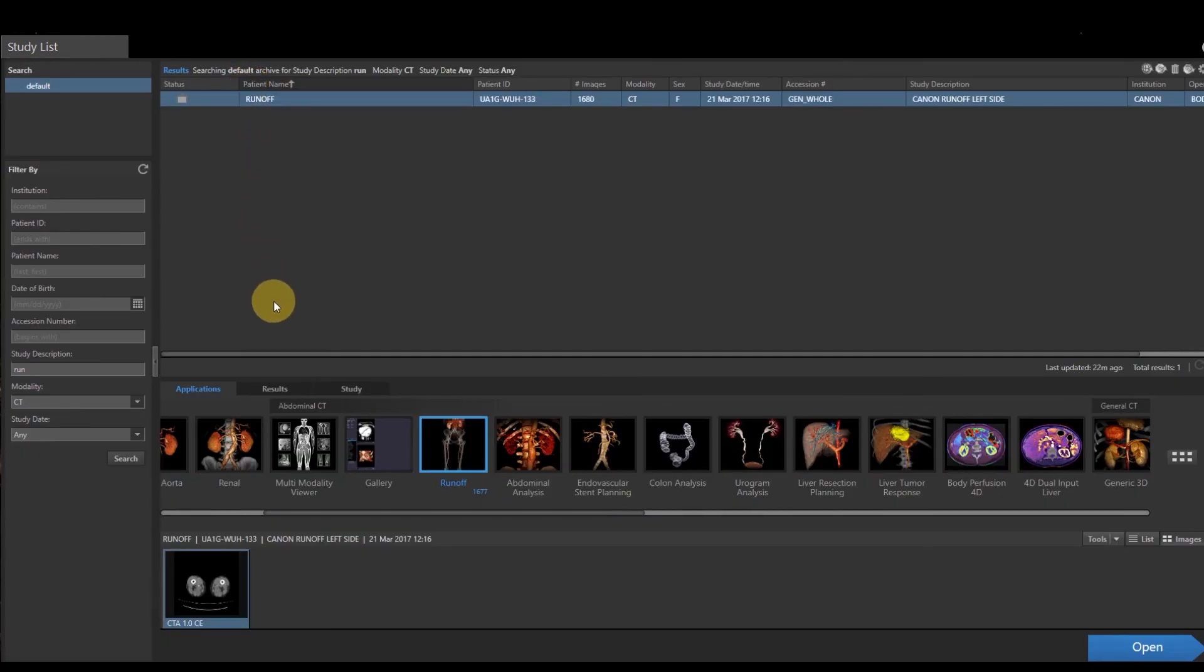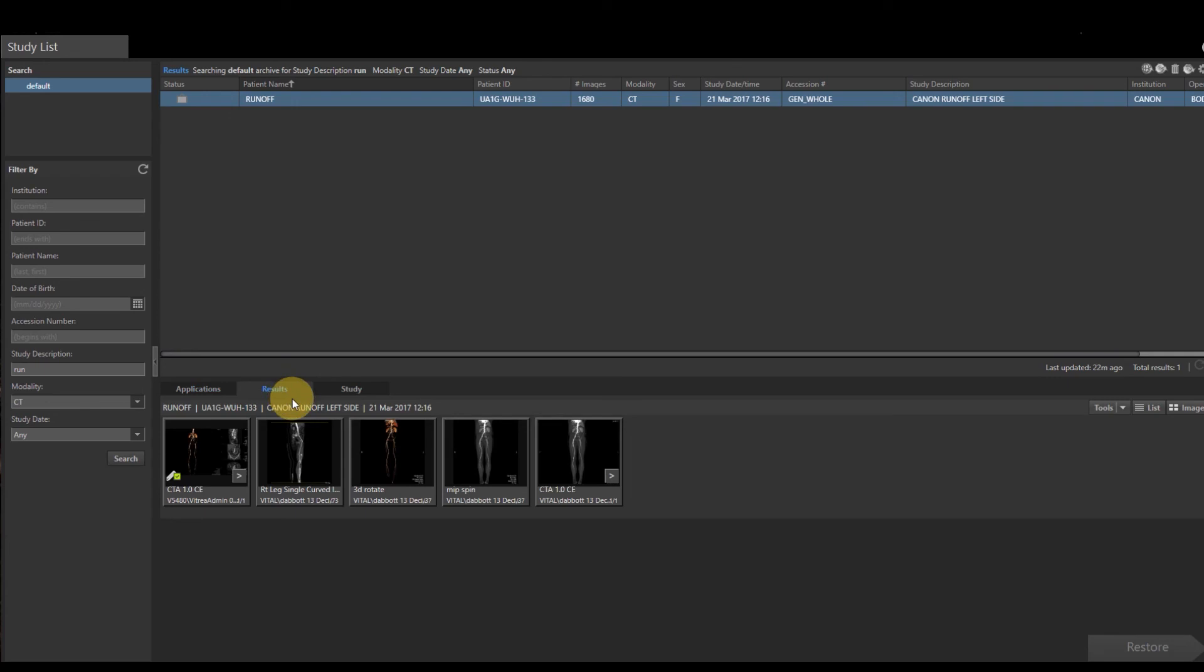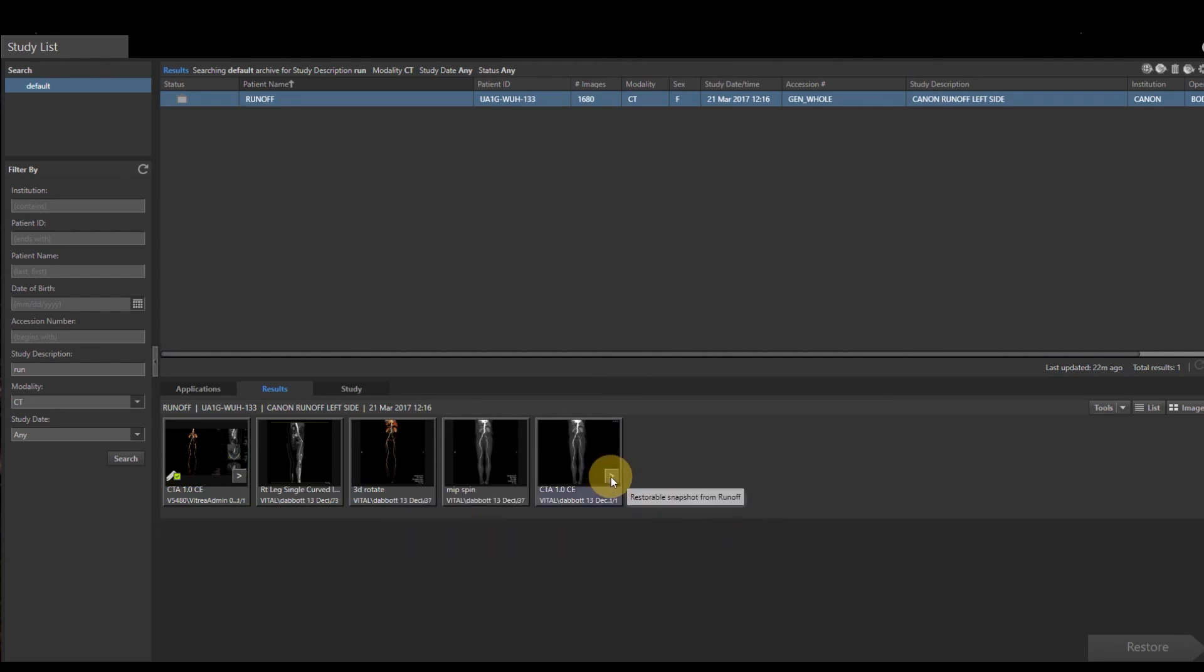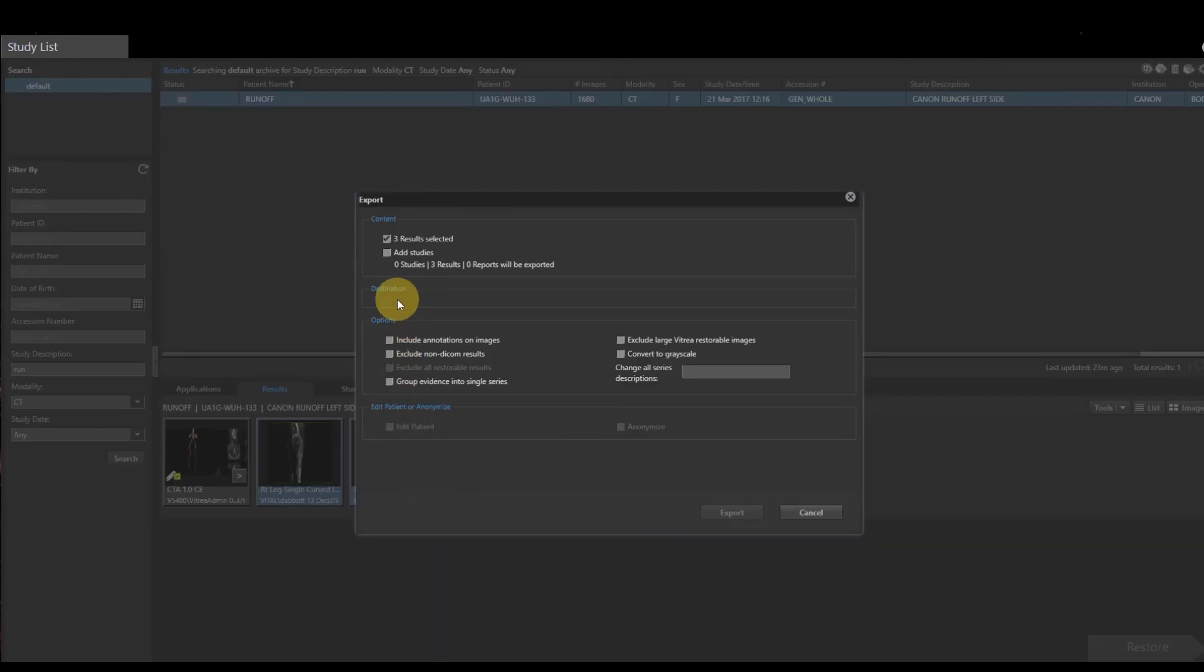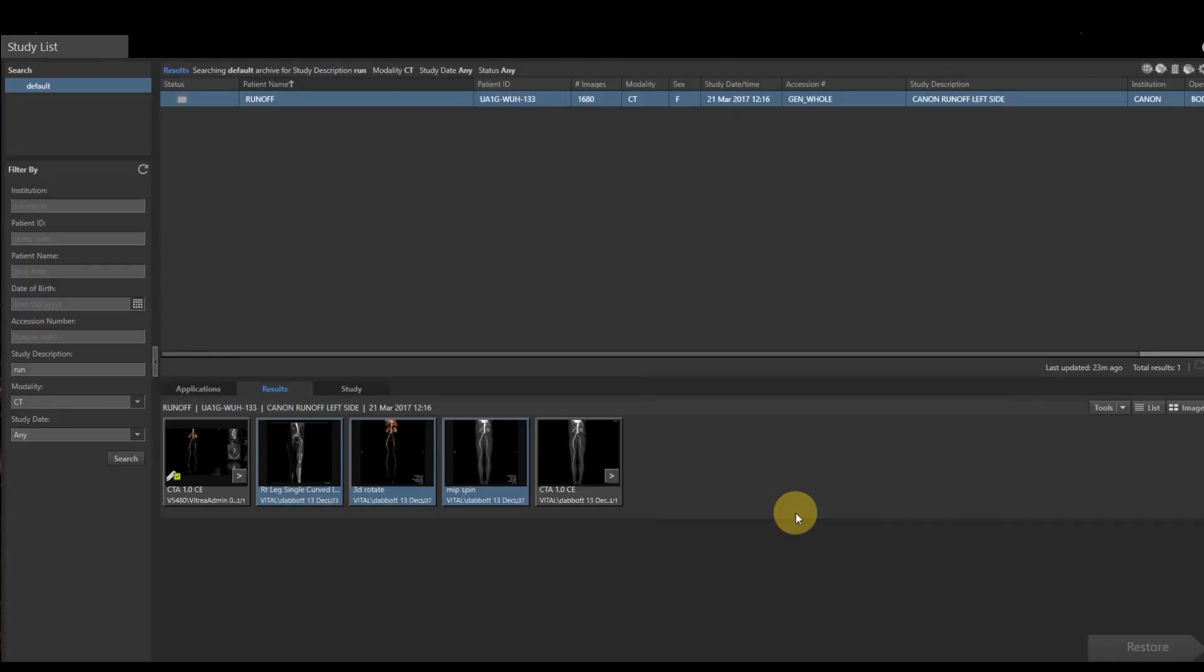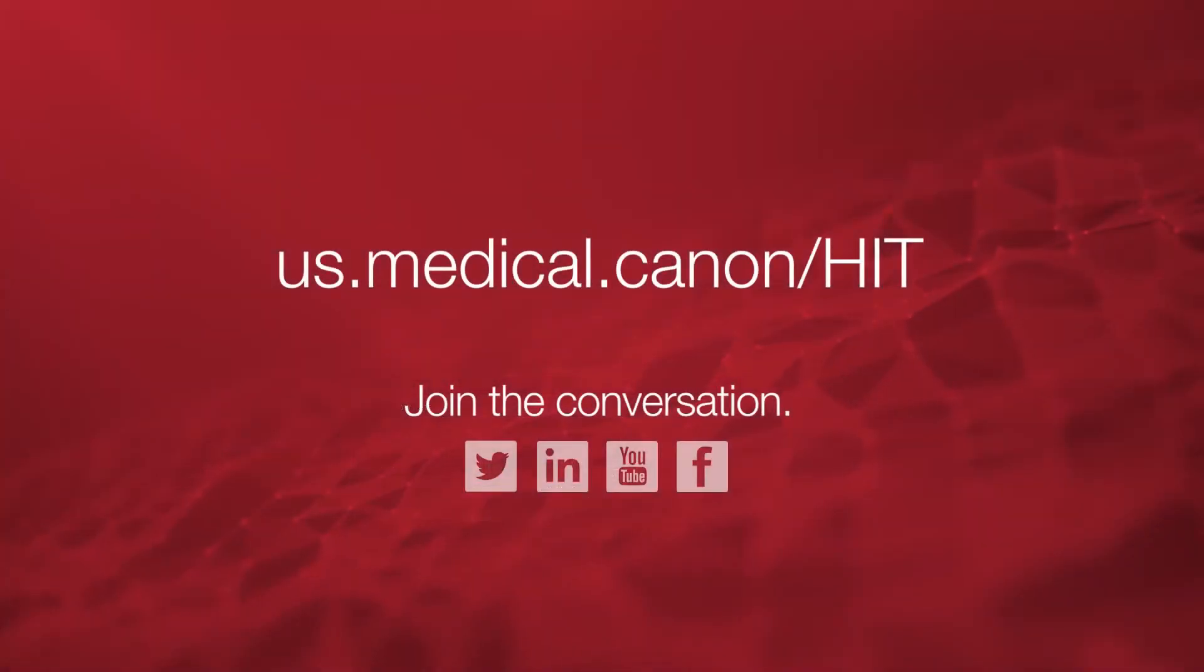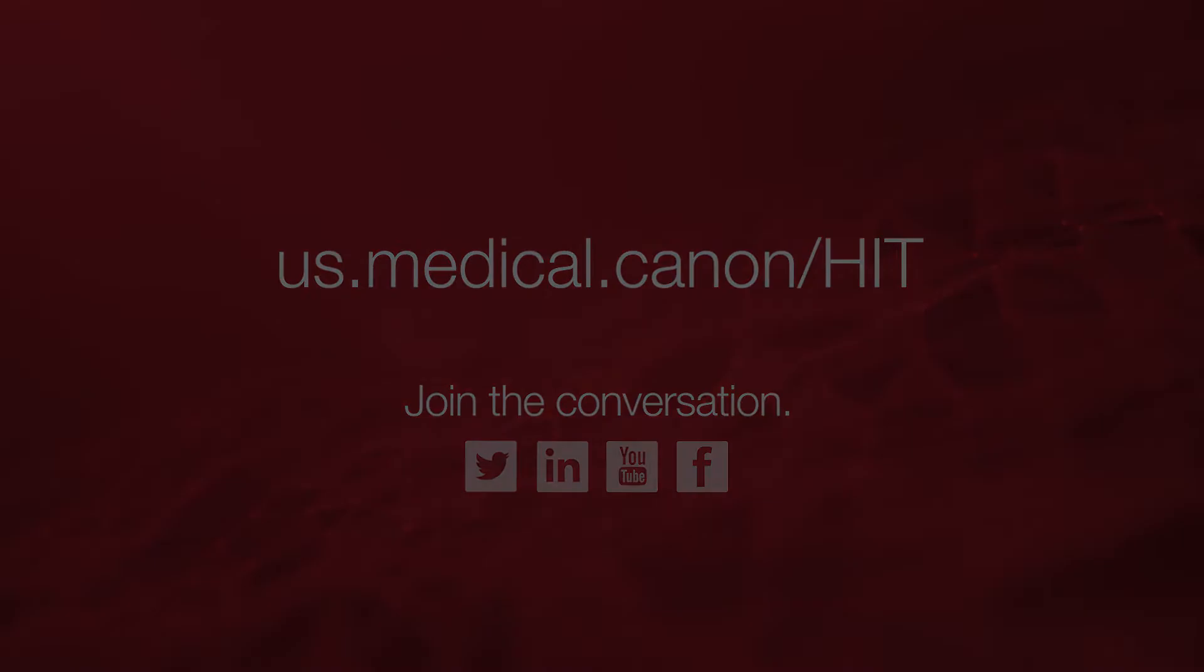In the study list, I want to come back to Results. My picture is indicated by a little arrow. Anything with an arrow is a restorable snapshot. I have my curved planar format and my two batches that I created. I want to hold down Control, select on all three, right-click, export. You're going to have a PACS destination already pre-selected, and then you're going to hit Export one last time. And that is a demonstration of the runoff application.